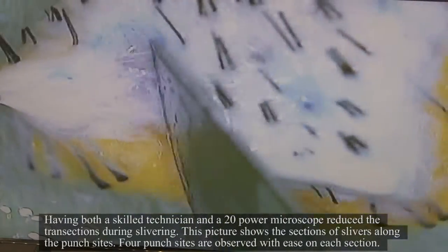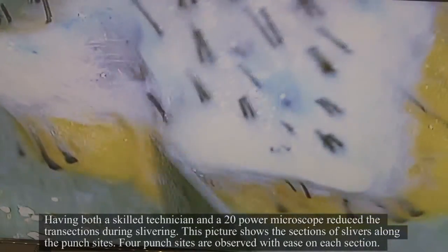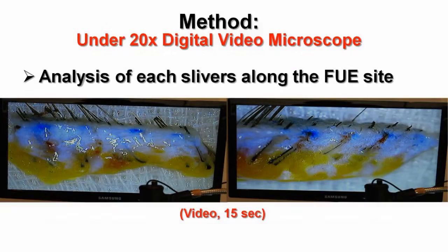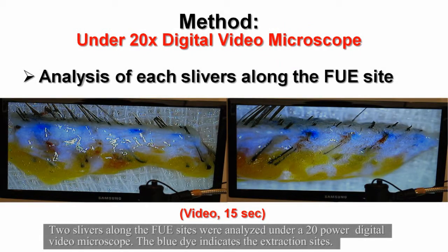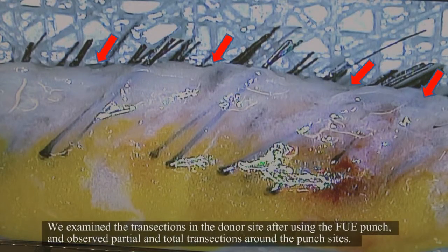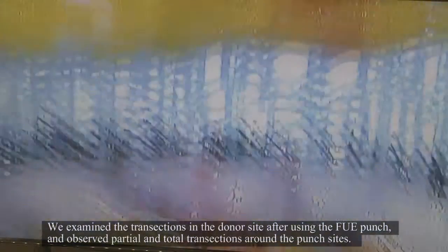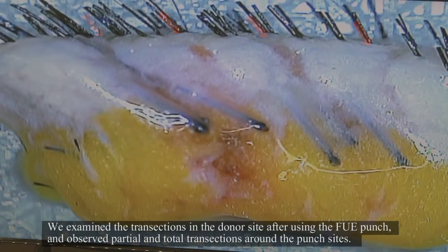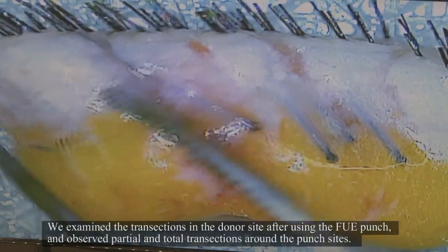This picture shows the sections of slivers along the punch sites. 4 punch sites are observed with ease on each section. 2 slivers along the FUE sites were analyzed under a 20-power digital video microscope. The blue dye indicates the extraction sites. We examined the transections in the donor site after using the FUE punch and observed partial and total transections around the punch sites.